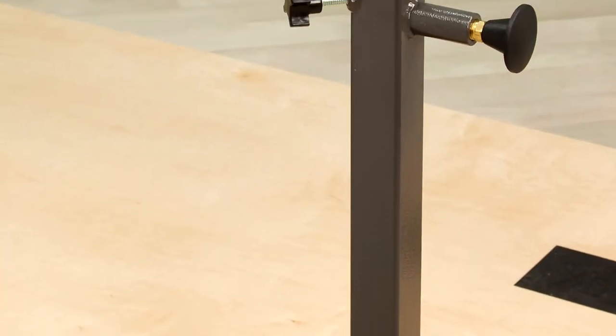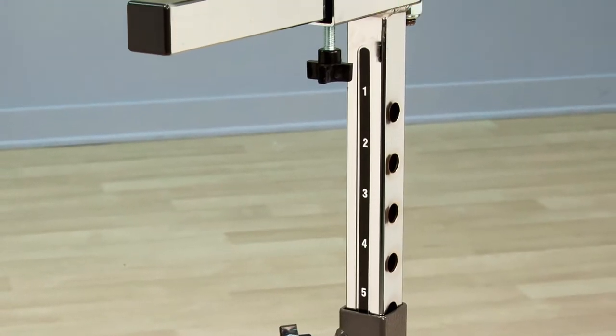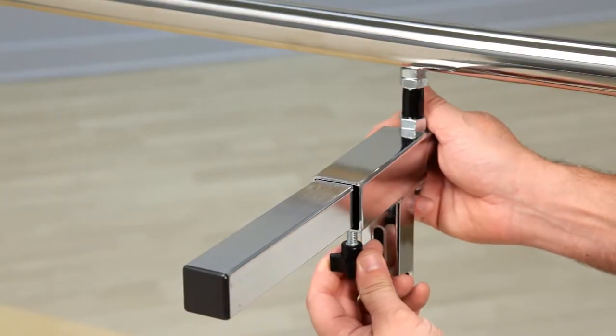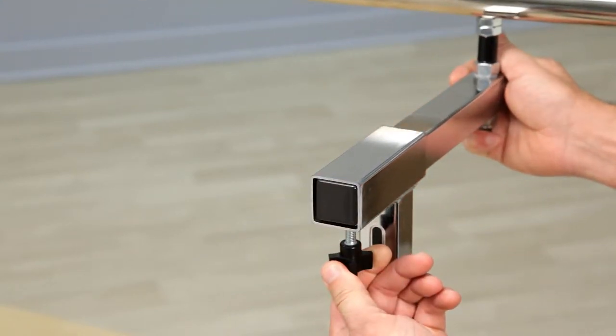Sturdy steel telescoping tubing provides smooth stainless steel handrails with plenty of support even across longer spans. Plus, Clinton parallel bars are adjustable two ways — vary the space between the handrails by adjusting the width adjustments at the top of each post.